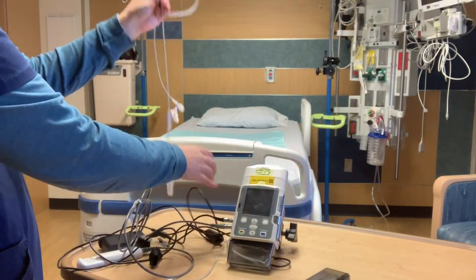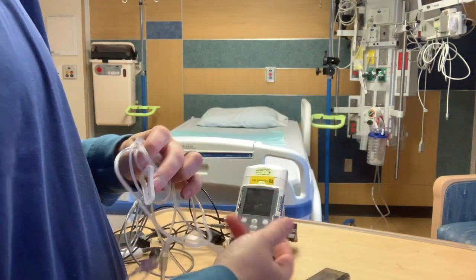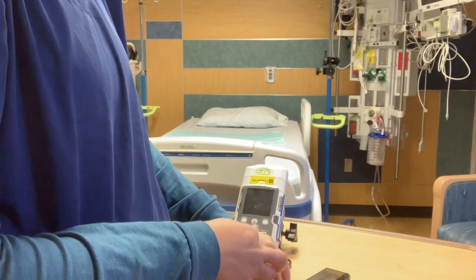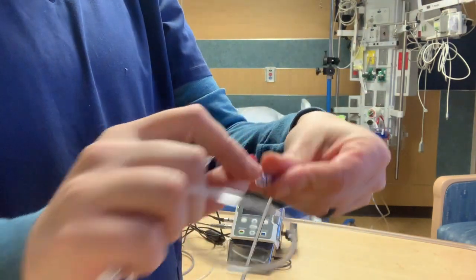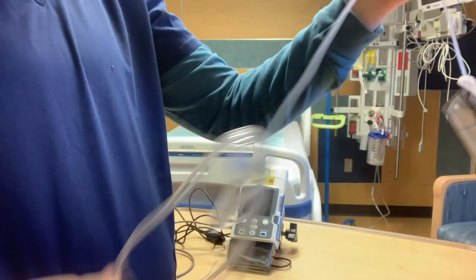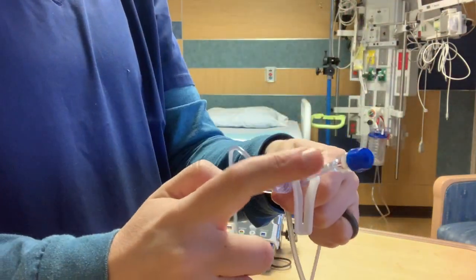This is the PCA tubing. When you're connecting it, the tubing will connect here on the CAD pump and then your primary fluids would be down here.